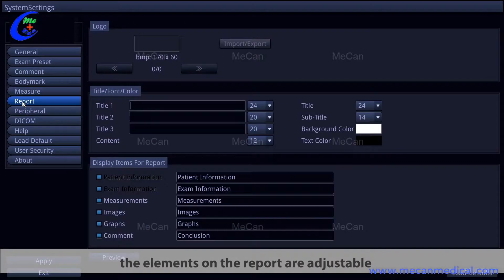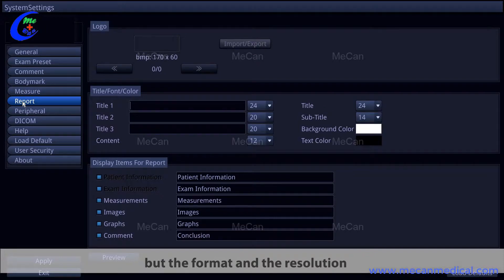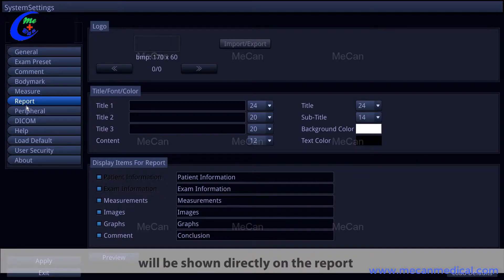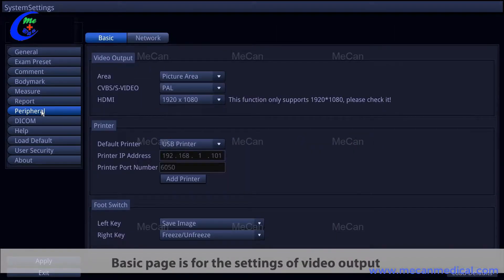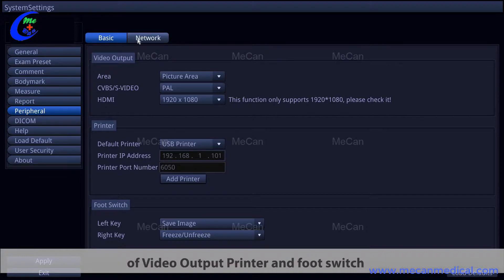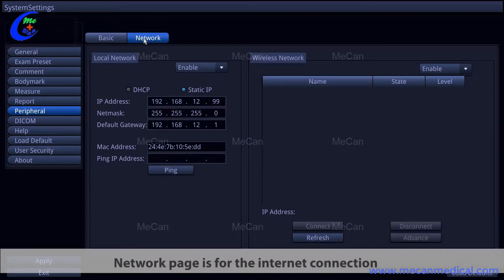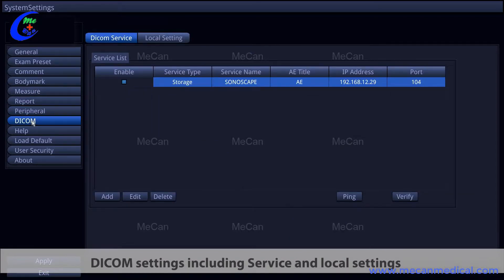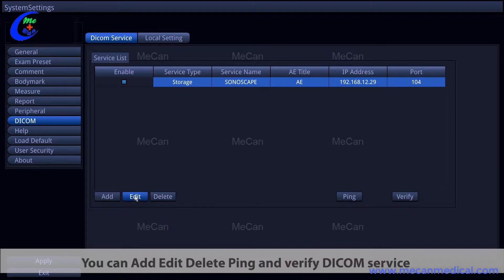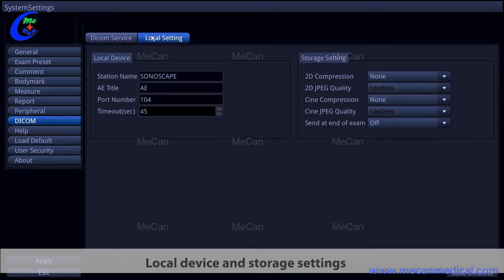Under the report item, report elements are adjustable and hospital logo importing is available, but the format and resolution must strictly follow the instructions. All adjustments made on this page will be shown directly on the report. The peripheral item has two pages: the basic page for video output, printer, and foot switch settings; and the network page for internet connection settings. DICOM settings, including service and local settings, are in the DICOM item. You can add, edit, delete, ping, and verify DICOM services on the DICOM service page. Local device and storage settings are on the local settings page.